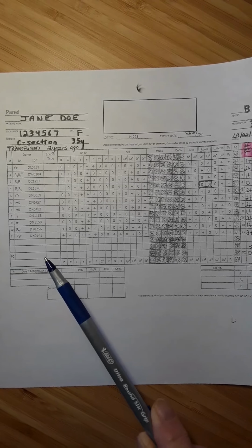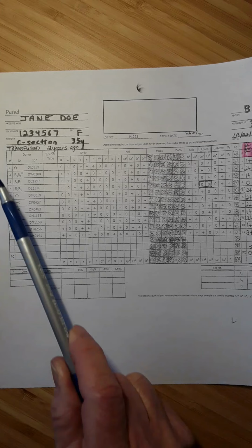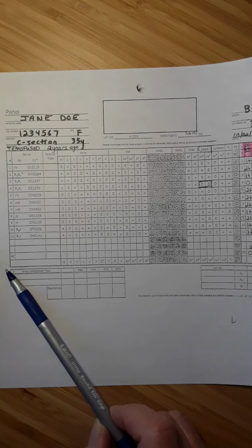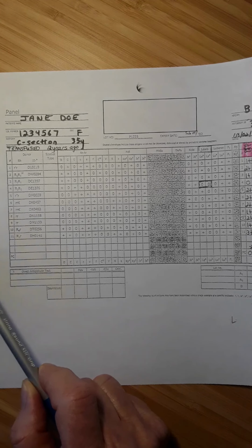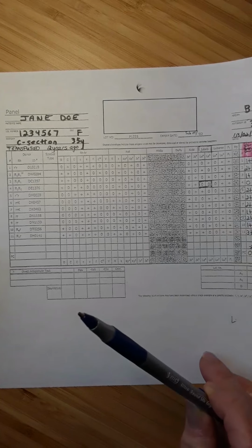What we did is take 11 test tubes and label them correctly, put the patient's plasma in each of the test tubes, and then to each tube we added the applicable cell. So we have 11 tubes, all with 2 drops of patient's plasma. Tube 1 has cell 1 in it. Tube 2 has panel cell 2 in it. Then all of those tubes received PEG and were put in the incubator at 37 degrees for 15 minutes.